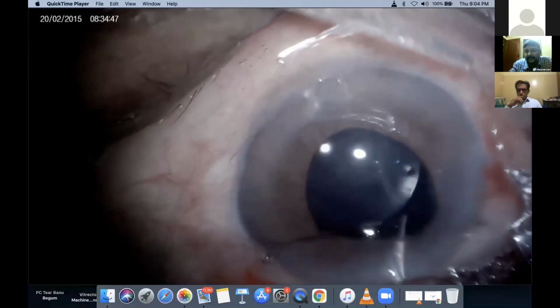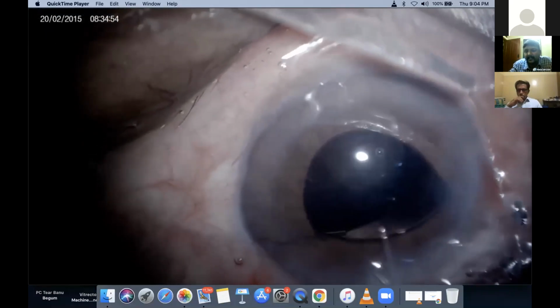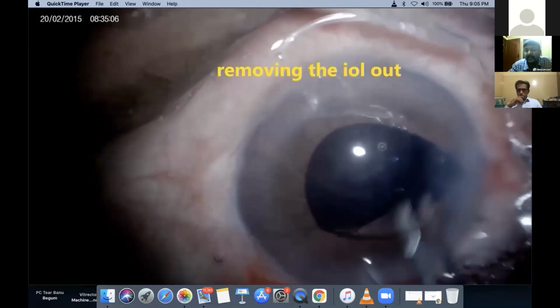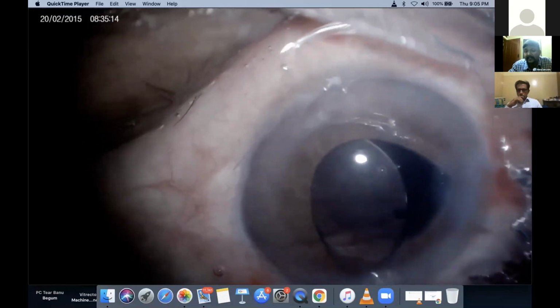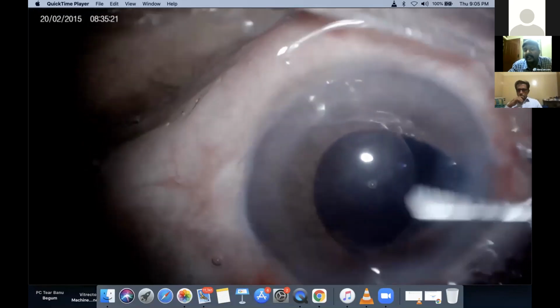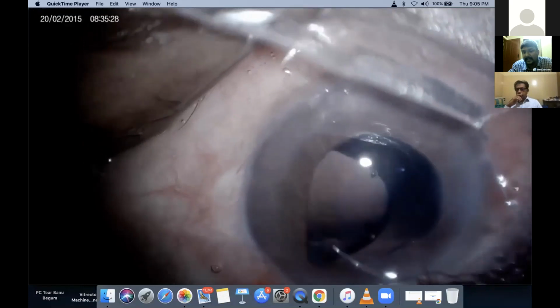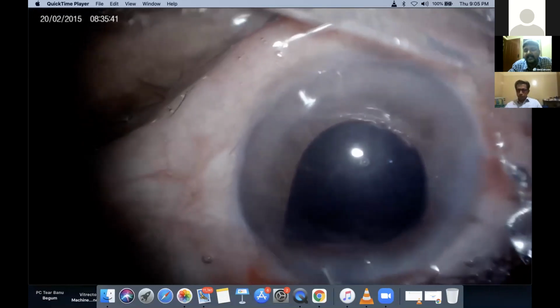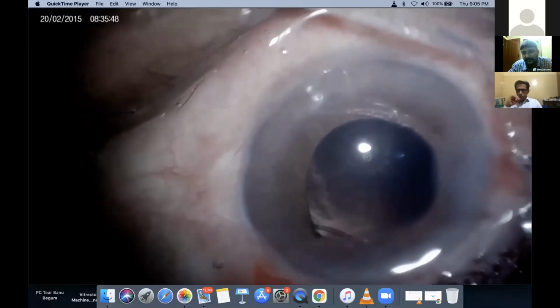So that's when I entered, and then I removed the IOL. It was stuck in the PC tear, so it was not an easy job. And vitreous loss was noted. That is when the IOL was removed, and then an open sky anterior vitrectomy was done.